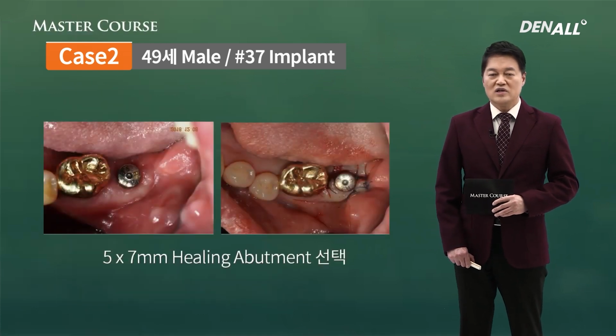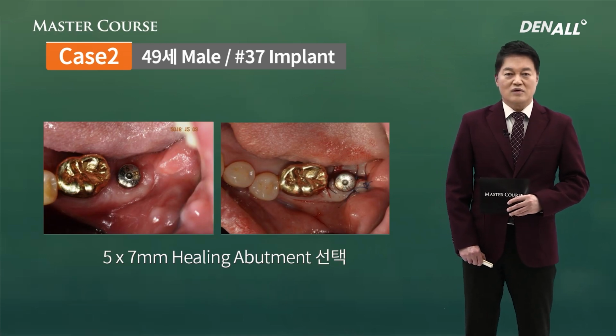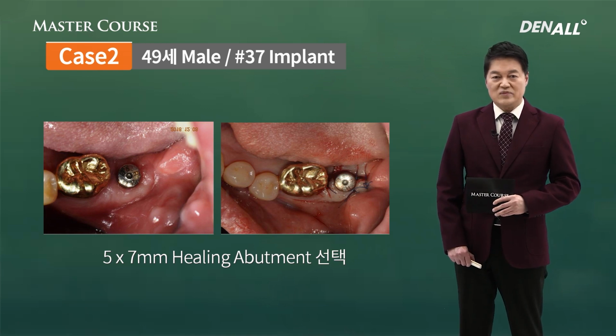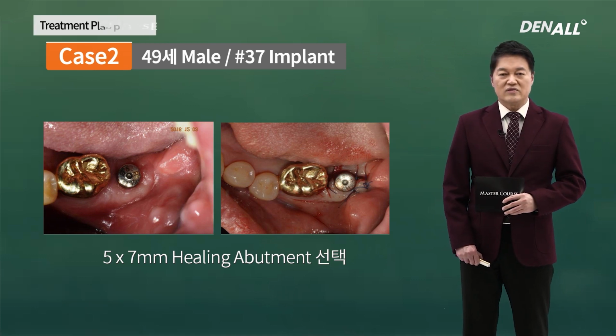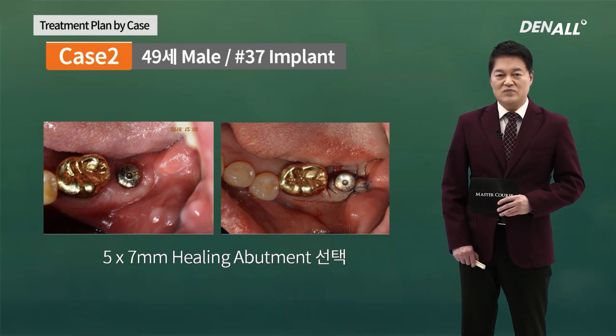It is removed and changed to a healing abutment. And this is after healing was done. For the healing abutment, you need to consider the size of the final abutment. So a 5 by 7 millimeter healing abutment was chosen.